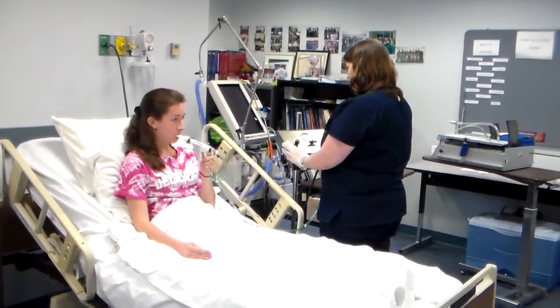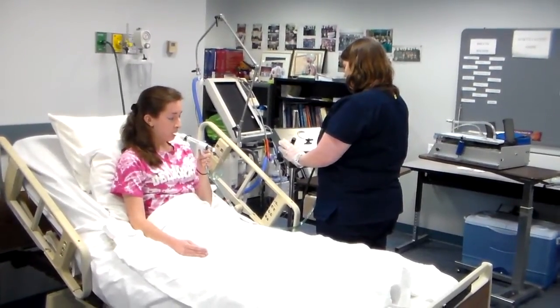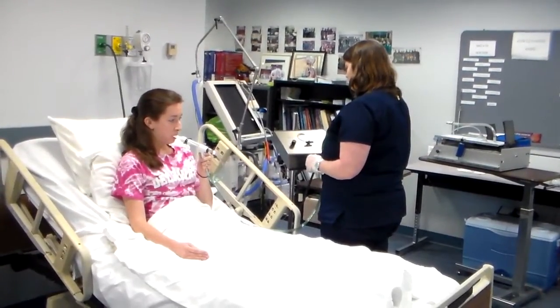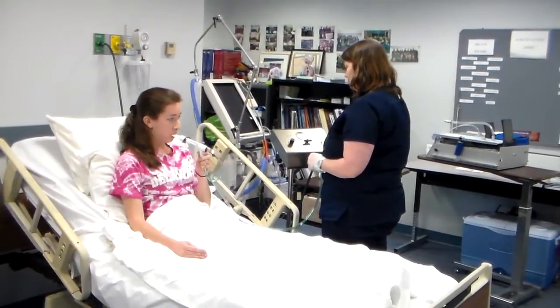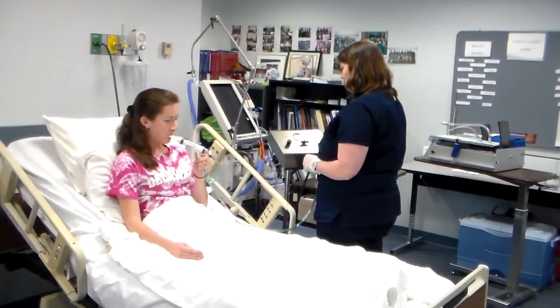When using the Metaneb, the amount of time the patient uses the CPEP and the CHFO depends on the individual. For patients with more atelectasis, the CPEP mode can be used longer. For patients with copious secretions, more time can be spent in the CHFO mode.